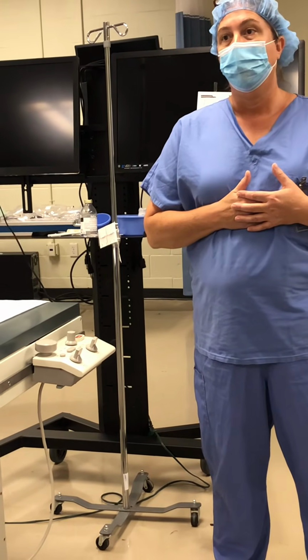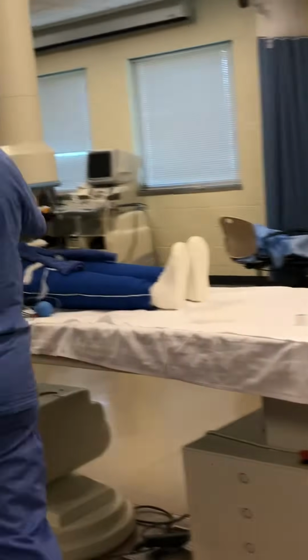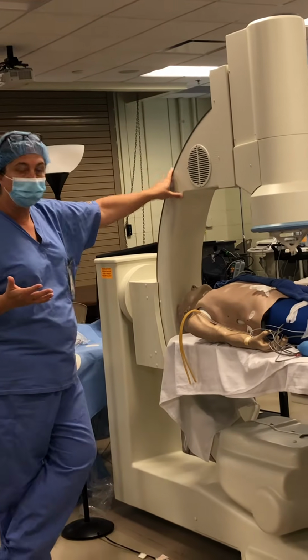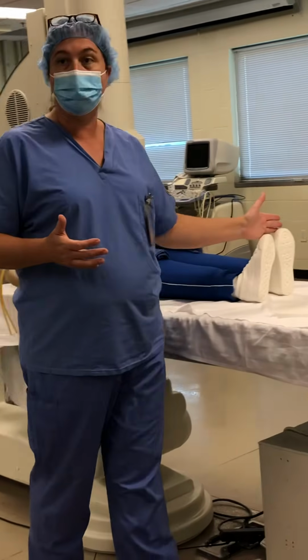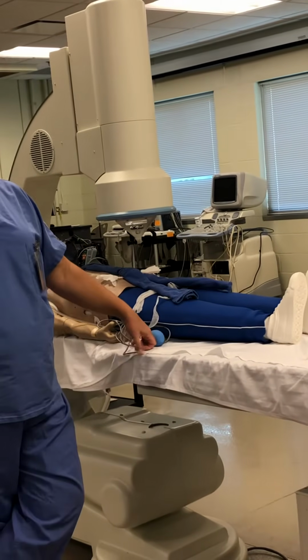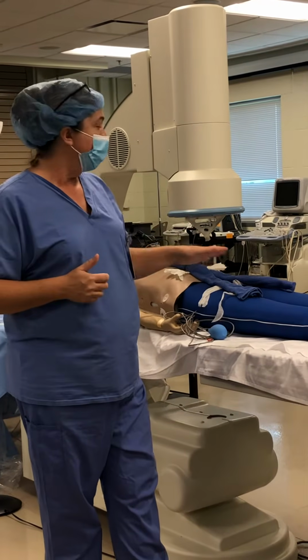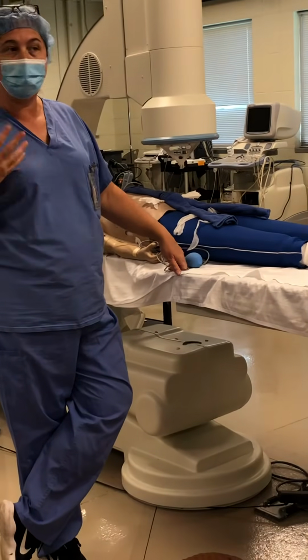okay? Now, we couldn't do it with this system because this C-arm does not move. But when we are really doing leg images, another picture we're going to do is called a bolus chase. And we're going to run all the way down to the toes. We're going to do a power injection of about 8 for 10, total of 80, or 10 for 10, total of 100. And the table, we're actually going to move the table with a hand control. And we're going to run all the way down the feet. We're going to talk more about that in lecture time as well.